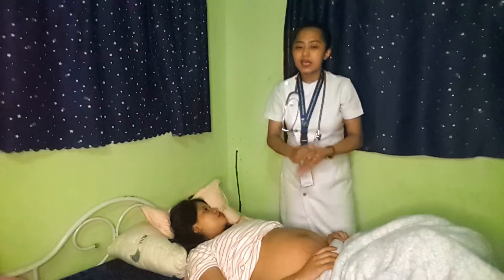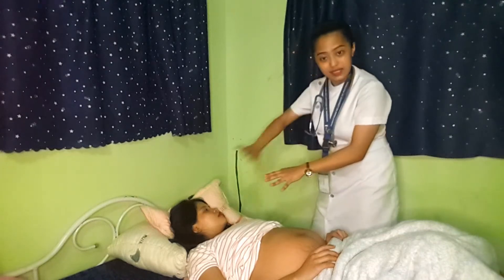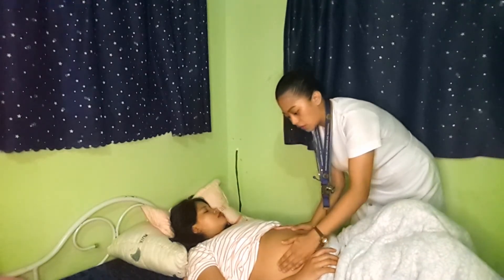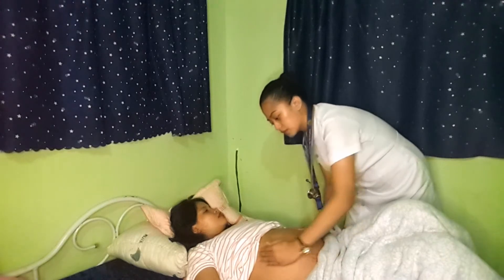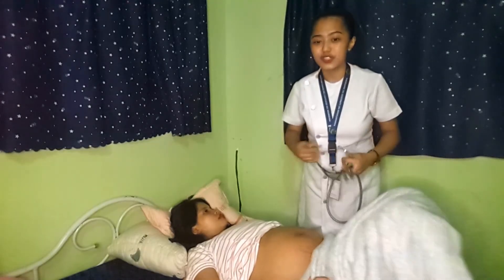The second maneuver is determining the baby's back. We need to face the patient and position our hands on each side — one hand will be the supporting hand. The back of the baby feels firm and long. Here, I feel the baby's back on this side. It is important for us to know where the baby's back is because this side provides the most accurate fetal heart rate. Because of that, we will now auscultate the fetal heart rate.